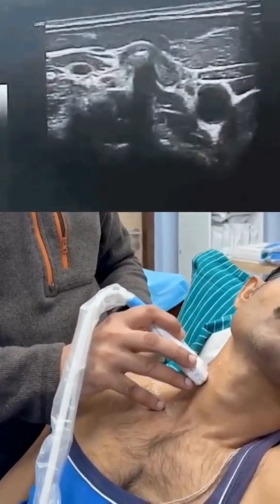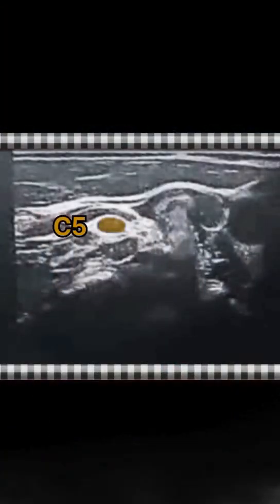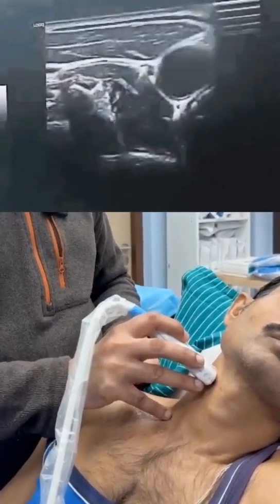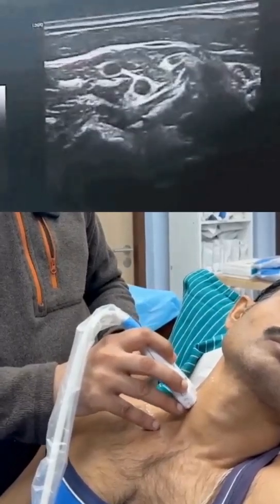The C6 nerve root has gone in. If I go caudally it comes out; if I go in again it goes in. The nerve root above is C5, and that's going into the vertebral foramen. So we've identified this is the C5 nerve root and this is the C6 nerve root. We need to focus on these.